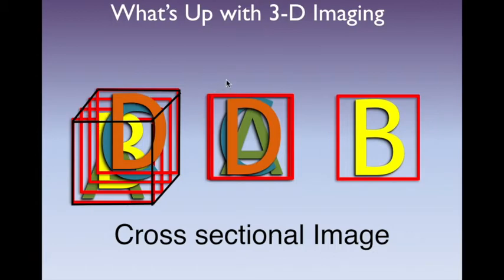Now, it might seem simple, but utilizing it properly for interpretation is a different story, because we are sometimes used to looking at the entire two-dimensional picture of our three-dimensional object, so that when we take a slice, a peek of a piece of that three-dimensional object, we sometimes lose ourselves in what we are looking at.